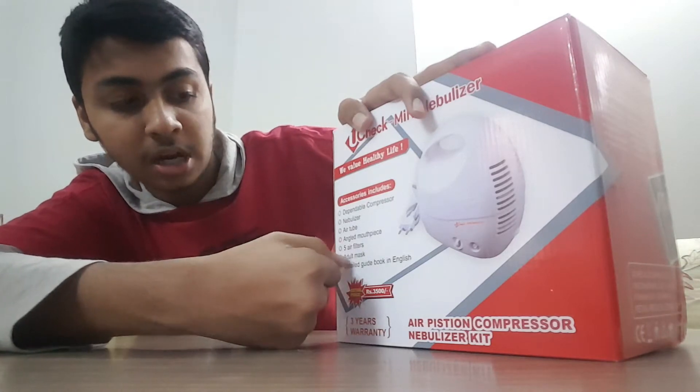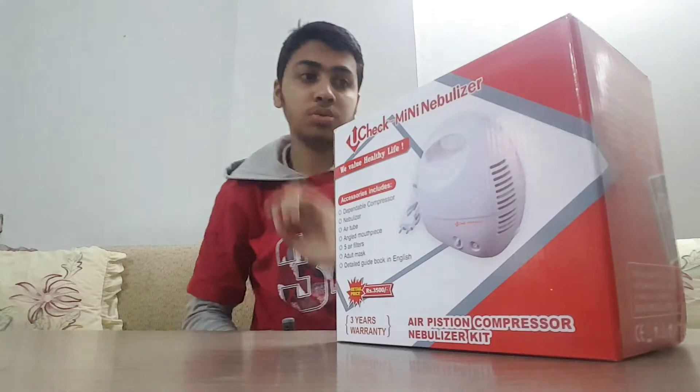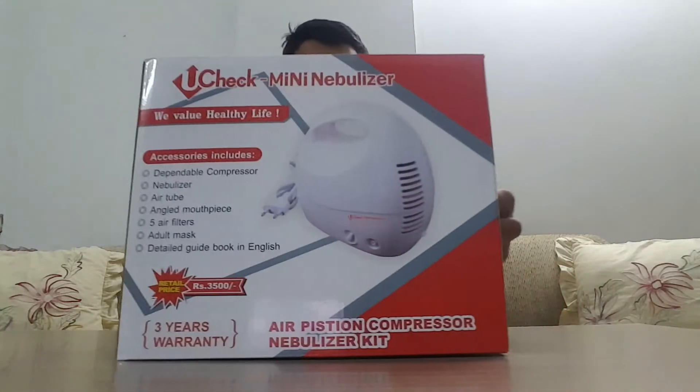This includes the dependable compressor nebulizer, a tube, angled mouthpiece, five air filters, adult mask, and detail guide books in English. There is also a user guide. So let's get to the unboxing.